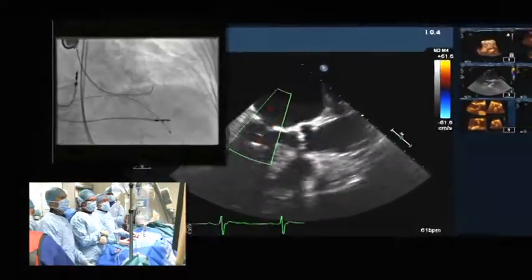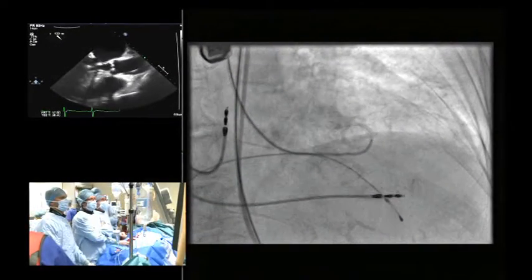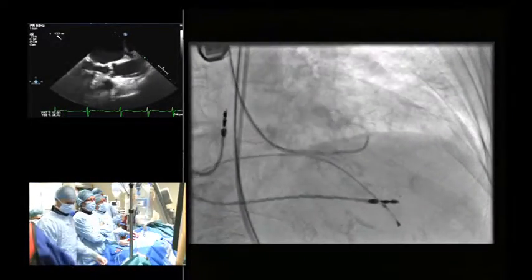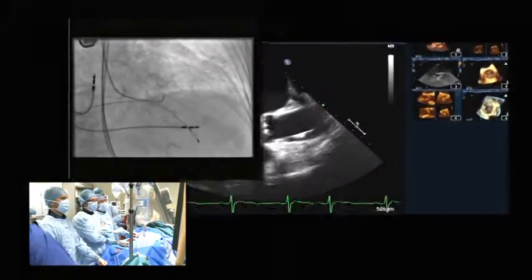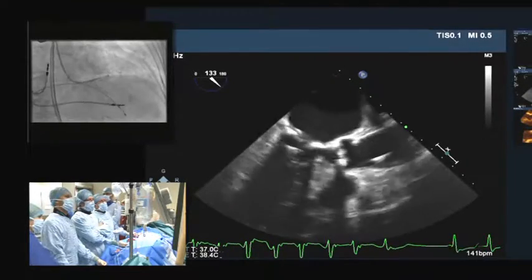So you can see the angulation on that pigtail here, which is it caught in the cords, Mark? Yes, it is, looks like it is. It's going right across the mitral. So what I'm going to try and do is torque it out of the cords. But it may not work, and we may need to cross the valve again, but I don't think we can accept that. A little bit of ectopy there, implying that I'm in the cords still.